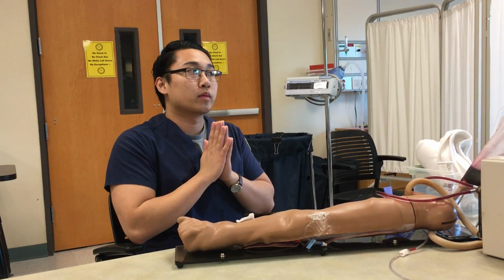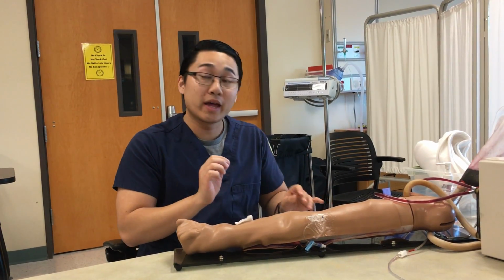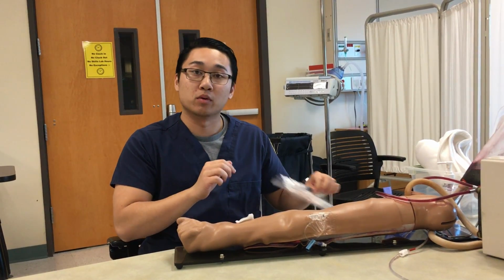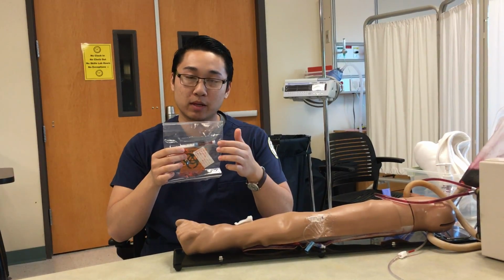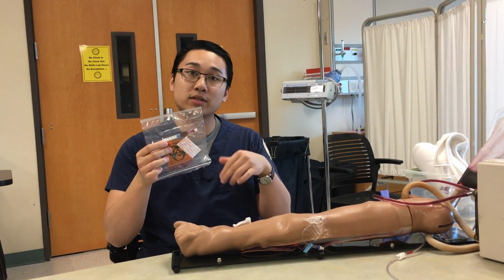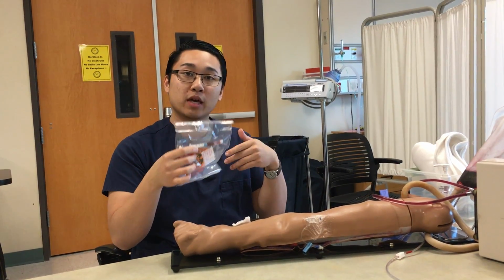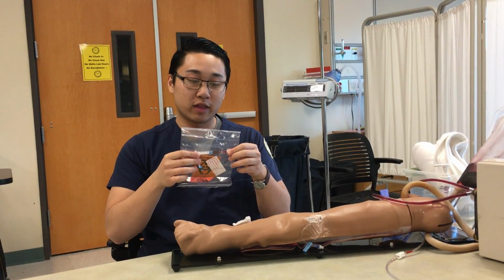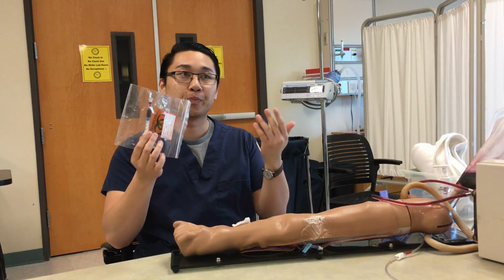And excess liquid heparin can obscure the sample by making it seem as though there is less CO2, which can make the pH higher, alkalotic. And the reason for that is that it dilutes the sample.